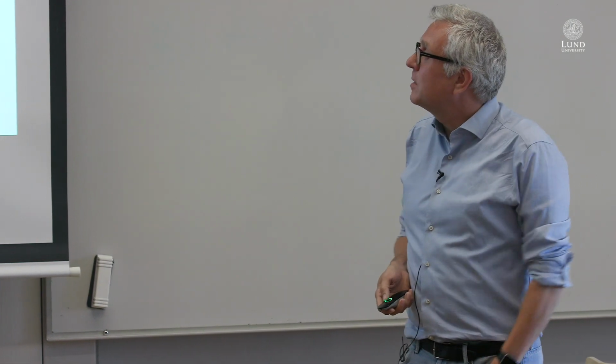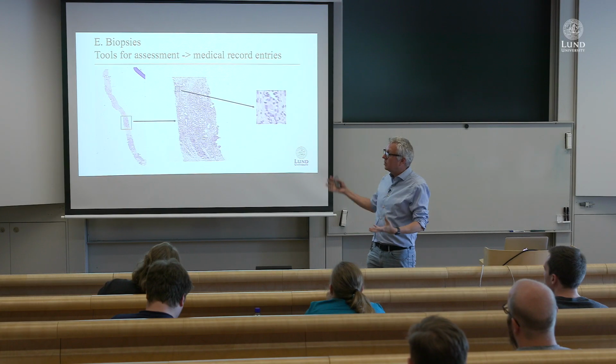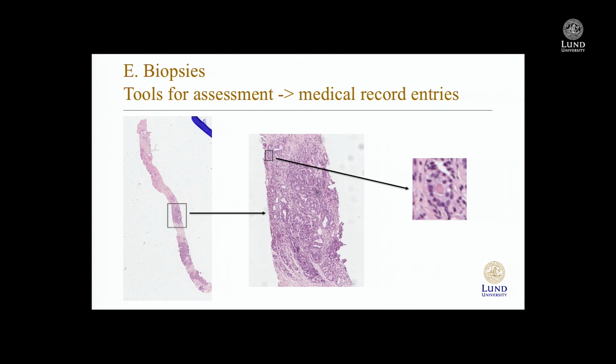So to wrap this up, what we've also done is that we've tried to put all of this together so that given these biopsies, we run it on the whole images and both segment out the different pieces and classify them as benign, Gleason 3, 4, and 5. And then we want to evaluate that with pathologists.